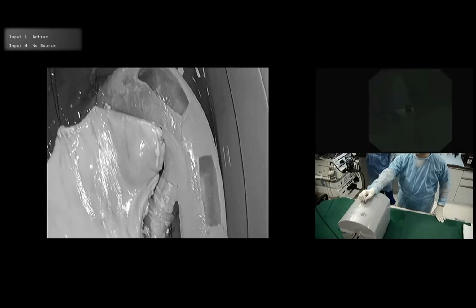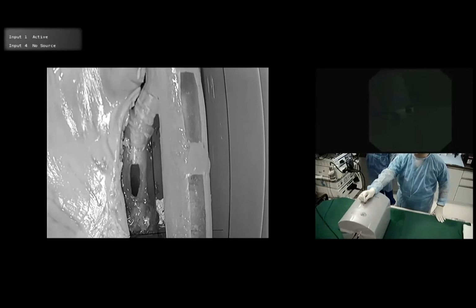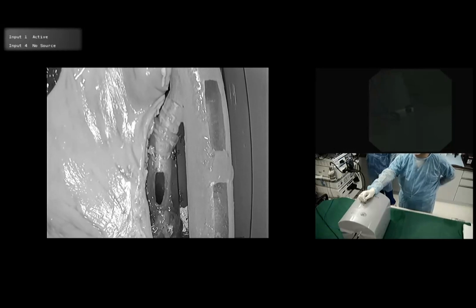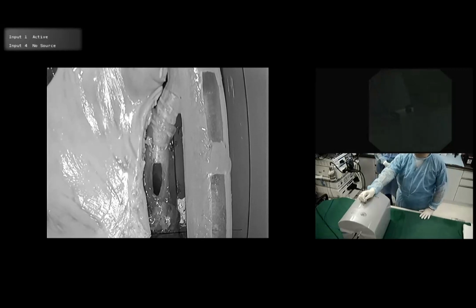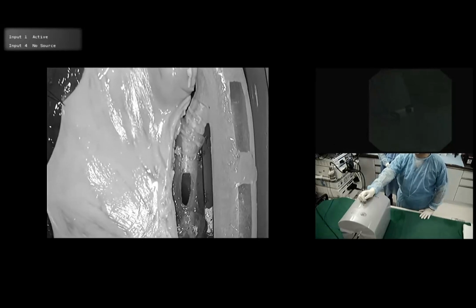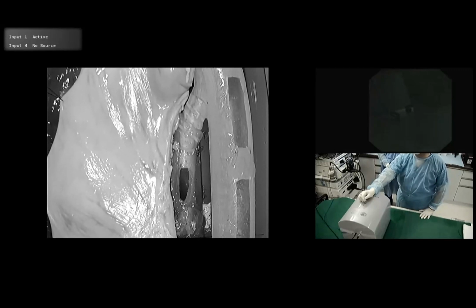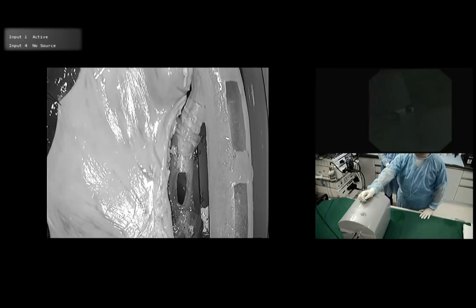And we have created holes on top of the duodenum so that you can see what is happening inside. Next to the duodenum, you see the papillary complex with bile duct and pancreatic duct. We have purposely created a very easy model. So the bile ducts are hugely dilated, pancreatic ducts are hugely dilated, so that it is easy for us to learn initially. But of course, we can create tubes with more complex, narrower bile ducts with multiple strictures, and that is not very difficult.